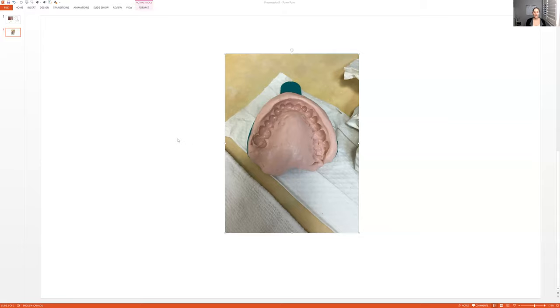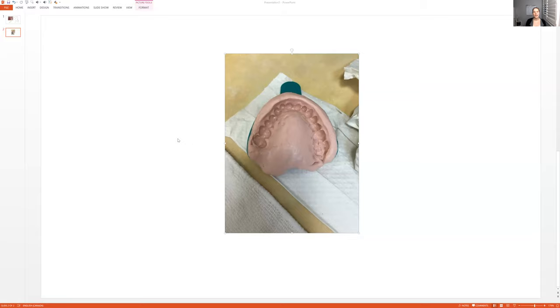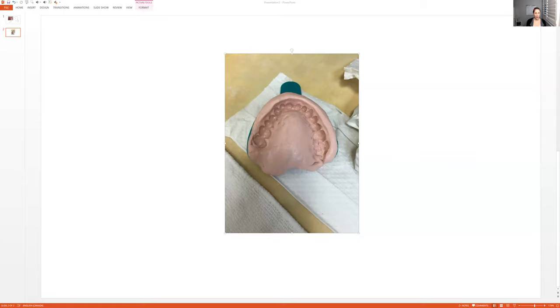Let them know that you are now mixing up the material for the top teeth or the bottom teeth, whichever one you want to do first. So what I do is just to keep it safe, I put three, the measuring cup, I wonder if I can find that online. Probably not. But the measuring cup, I fill it up to the line that says three with room temperature water, not too hot, not too cold.